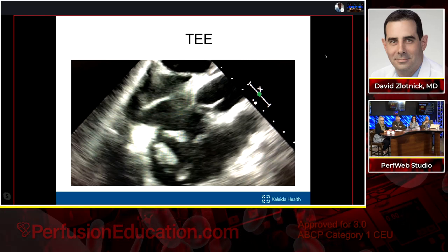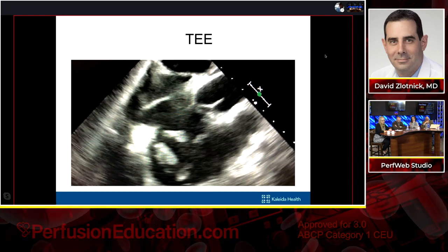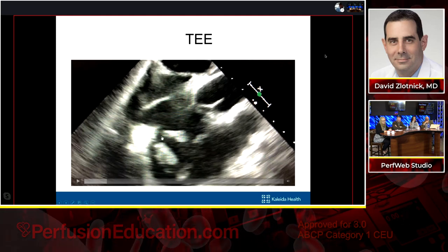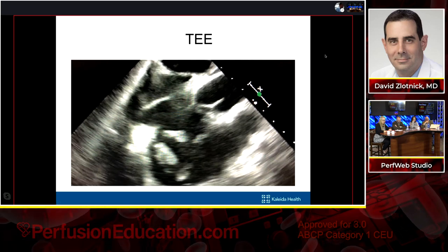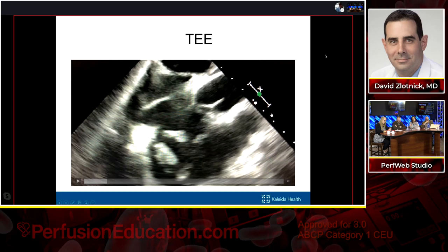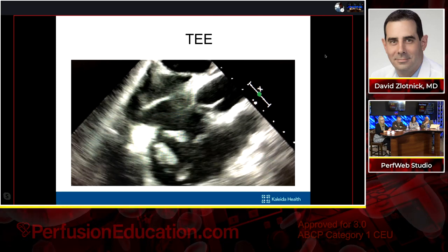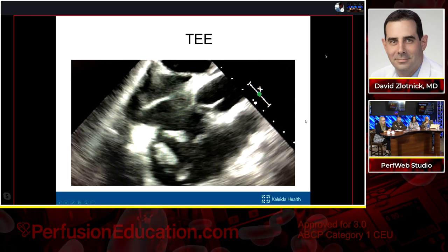All right. So it seems like every time I play a movie, we freeze for about 30 seconds. So I'll just wait till you guys come back. But so there's multiple frond-like vegetations attached to the tricuspid valve. So this is really where we were going after. And I'll let the next movie play, but what it'll show is the AngioVac coming in from an IJ approach, so coming from the SVC into the right atrium, coming down on the tricuspid valve. So I'm going to show that now.